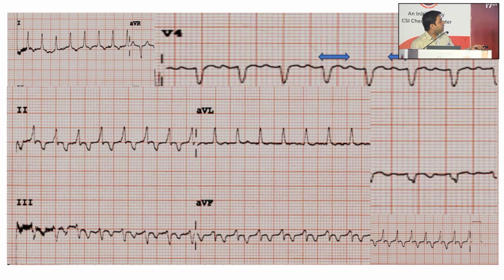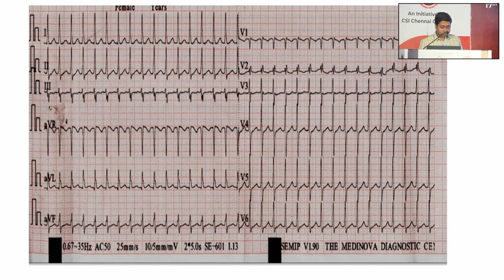So most probably the P wave gets buried into this negative T wave, due to which the T waves become prominent. And as the P waves in the inferior leads are negative, it generally suggests it is retrogradely conducting, so most probably it is AVNRT. When we took this patient for an EP study and ablation, we found it was an atypical AVNRT.